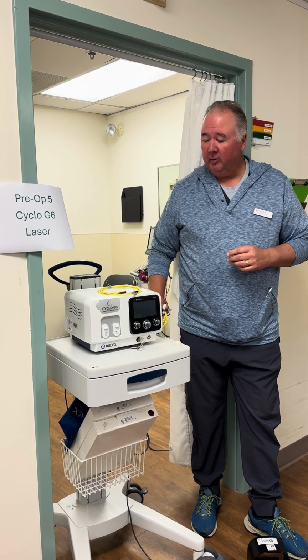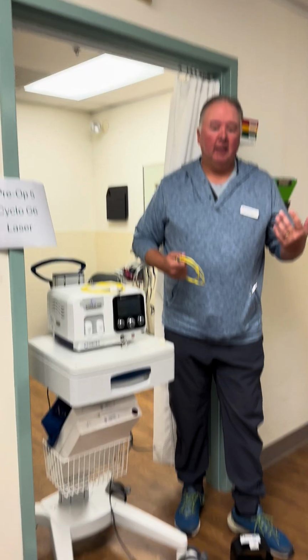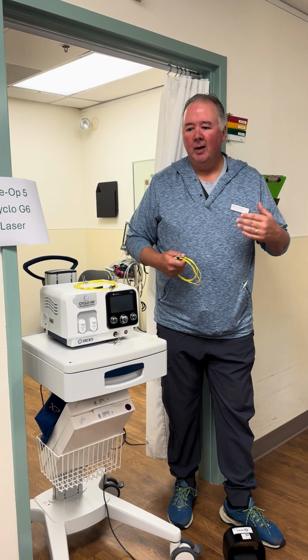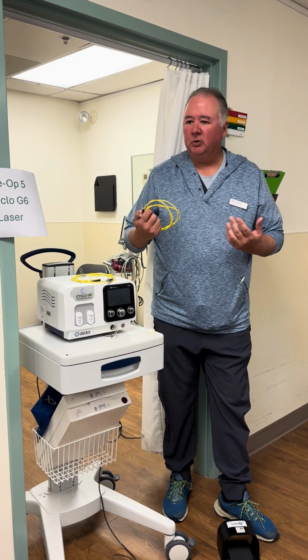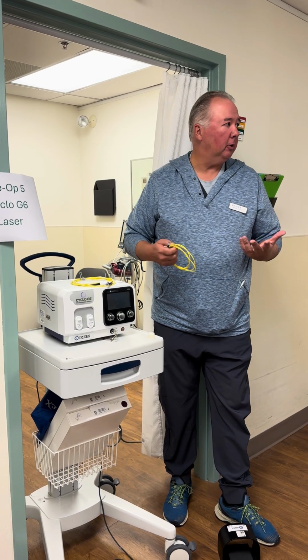The G probe is for more advanced glaucoma, people that maybe have hand motion vision or count fingers, they have a painful eye, they're on several medications. This is just a procedure that's going to help alleviate some of that pain and reduce the pressure for the patient's eye.